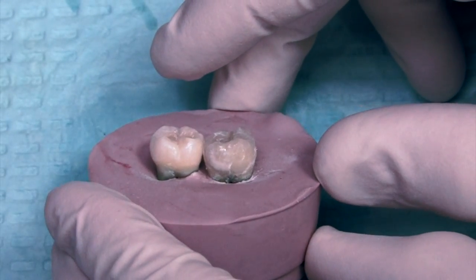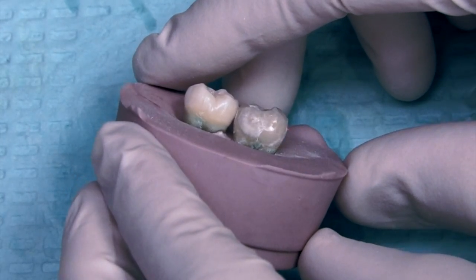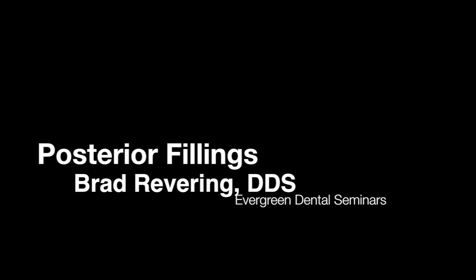So there we go — we placed three fillings. That would occur much faster if we were doing this intraorally, but that's how we do fillings. Hopefully this has been helpful for you. Thanks.